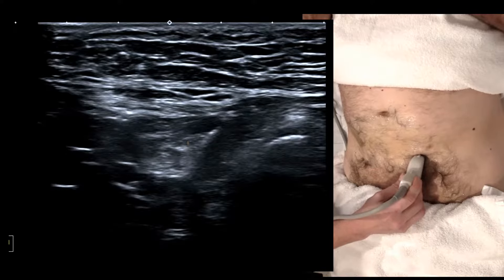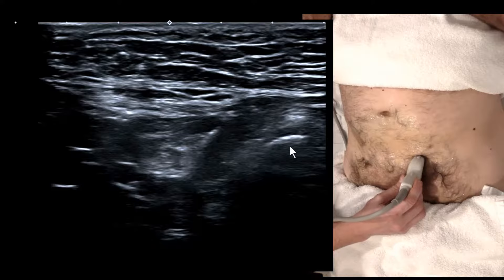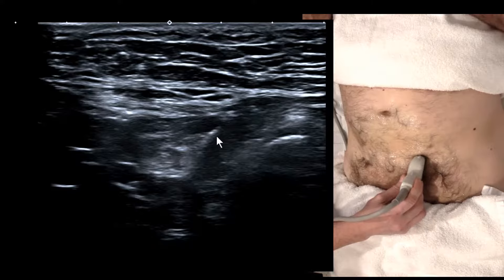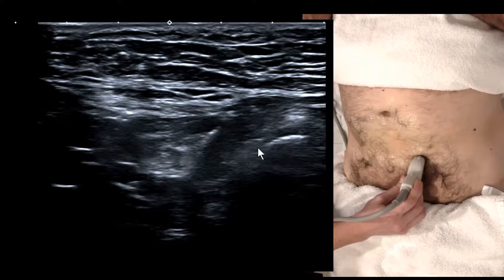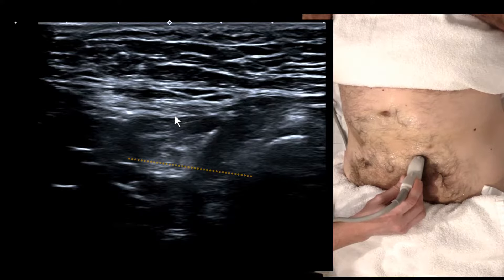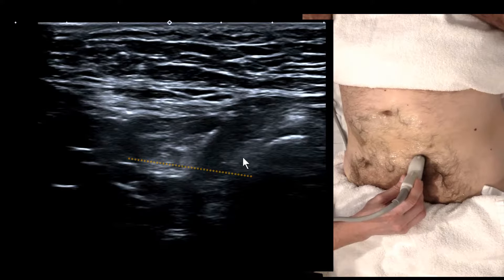If the defect is located immediately above the pubic tubercle, we're in the region of Hesselbach's triangle, which is the weakest point of the inguinal canal. The only thing holding bowel and fat inside is the peritoneum and a thin layer of transversalis fascia.